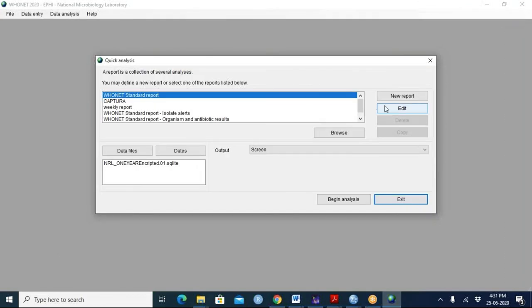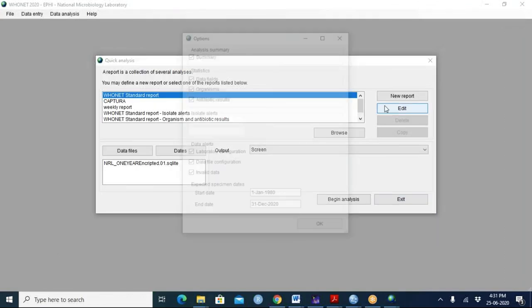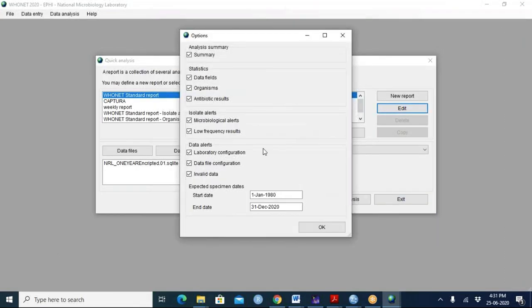Click on Edit. So you can see here, this did a lot of the stuff we already saw today. The difference is that this is much older. The advantage is it's concise. It's easy. It's not all the details. We're trying to make a PDF file. So for the stakeholders, that's easier to share. Excel files are great, but there's a ton. Whereas this is much shorter. What I don't like is that it's not configurable.